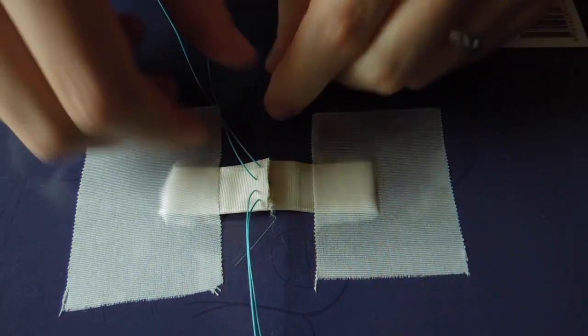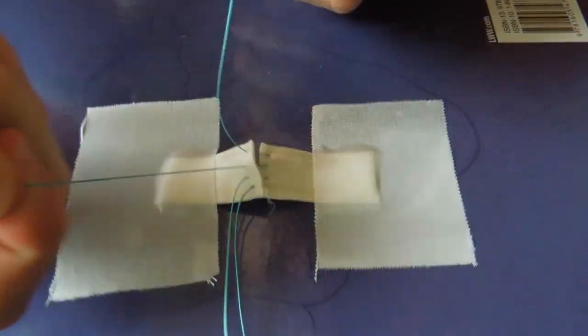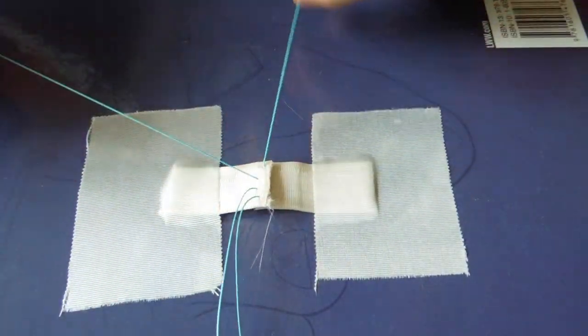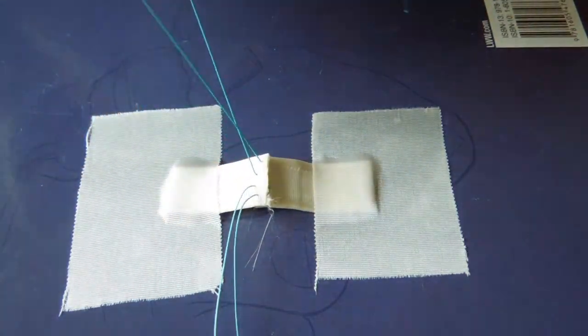When we pull that down, we see the overlap of the left side over the right side, and now we're going to individually tie each suture here with hand ties.